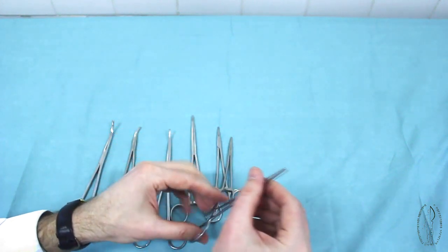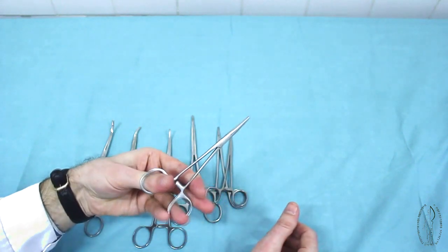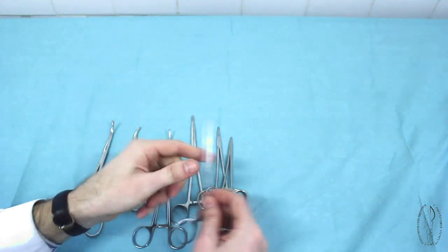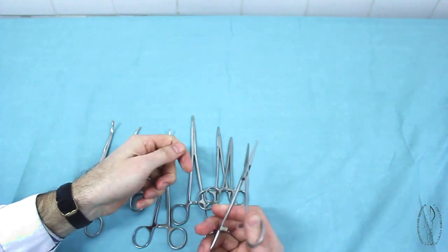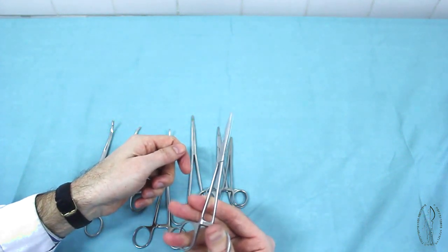During manipulations with hemostatic instruments, it is important to open their ratchet not only with the right, but also with the left hand. This fact increases the efficiency of the surgeon's or assistant's work.